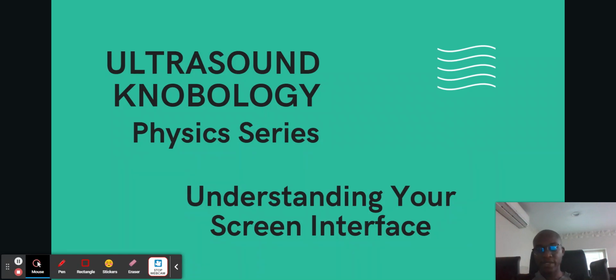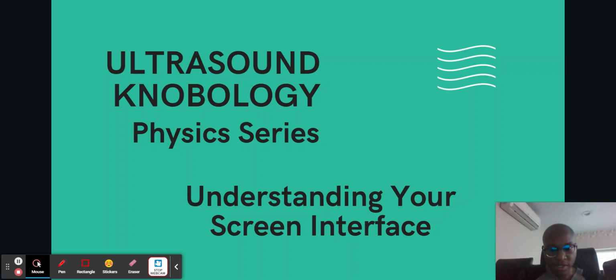Welcome to today's series in physics, ultrasound knobology. What we'll be discussing today is understanding your screen interface. Understanding your screen interface is where we are going to start from in this series of physics. There will be other tutorials that will come along the way, but we are starting from understanding the screen information.